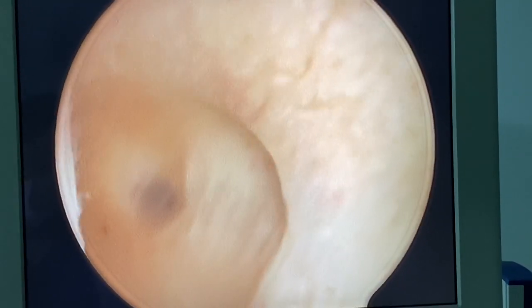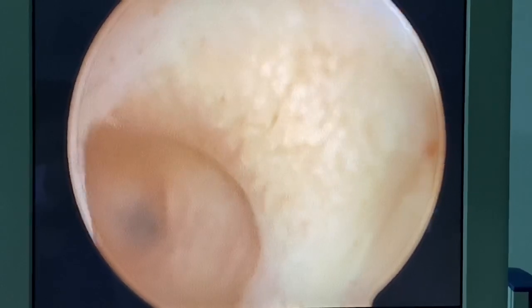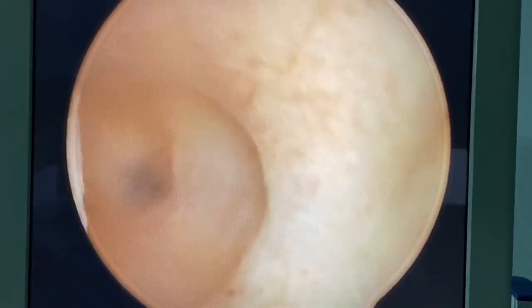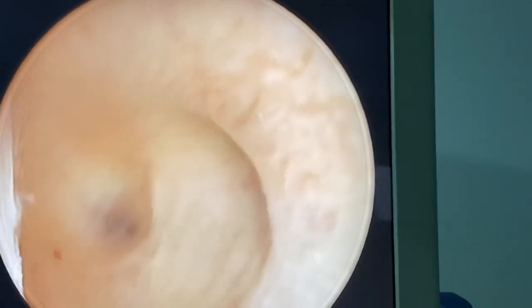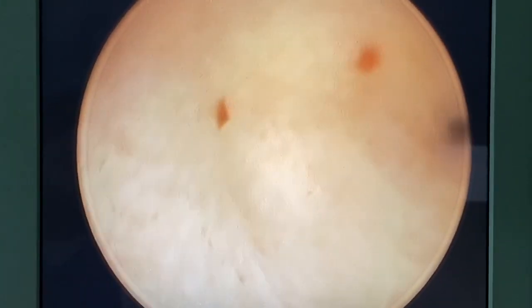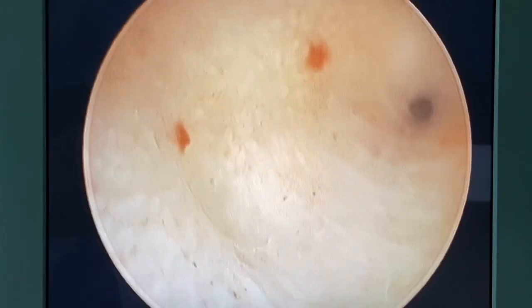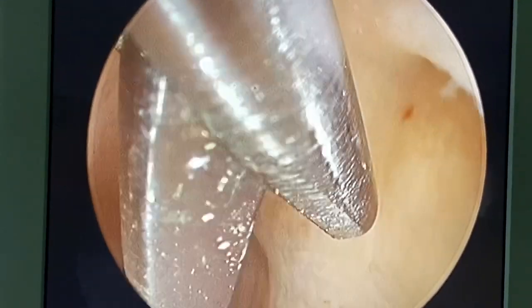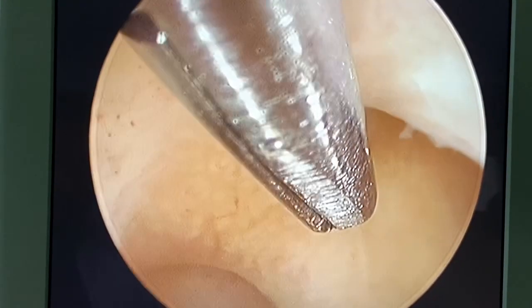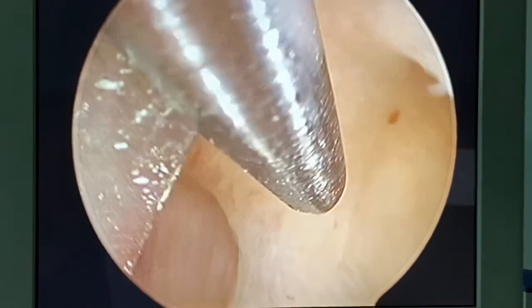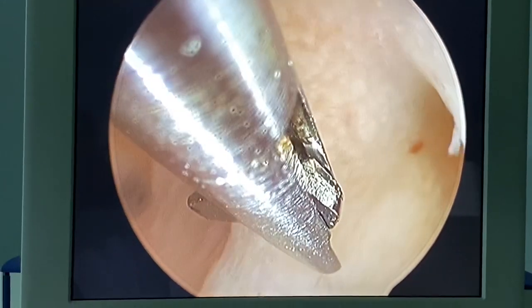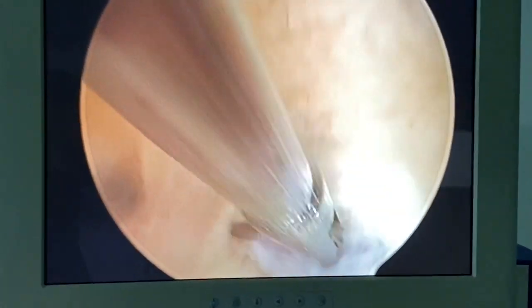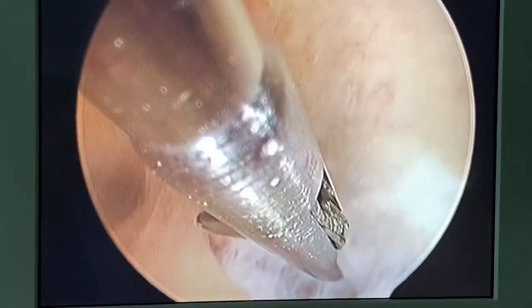I will open the inflow more and close the outflow to get more pressure, and try to find the strategy. Inspect both ostia. Adjust the focus and rotate gently. This is the rotation of the scissor, and this is the rotation of the whole system — please appreciate that. You have to master the rotation of the whole system to see the tubal ostium. Go with the scissor and cut. Always have a view of the tubal ostium because this is the landmark — it tells you when to stop.